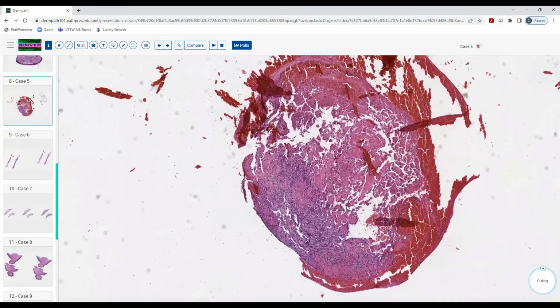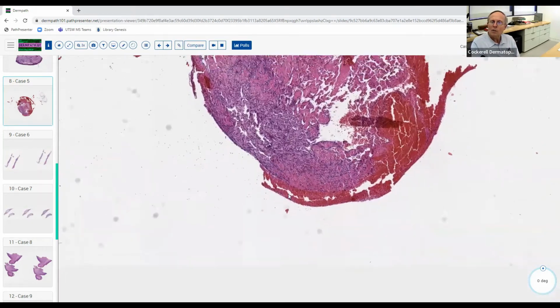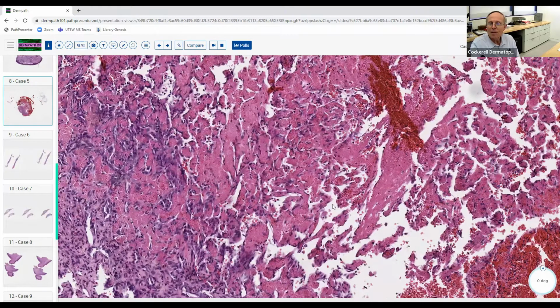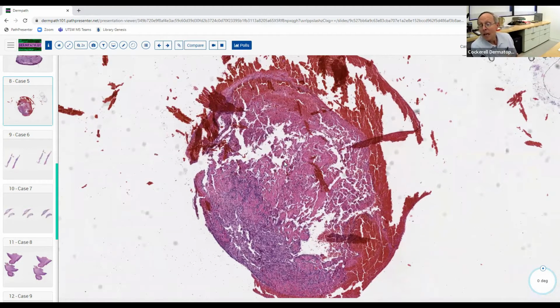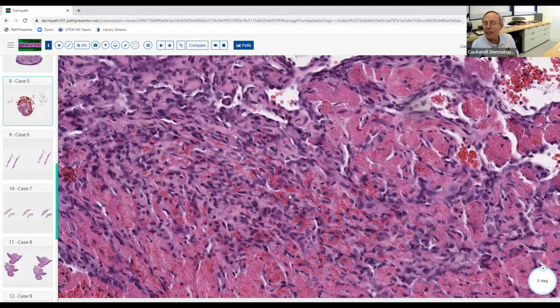Is that hemangioma? Well, it's not just a classic hemangioma, but notice the architecture, the fact that it's got this very round appearance. It looks like it maybe just popped out of there. It's got all this fibrin and inflammation and red cells here. Is that thrombosed? Yes, it's a thrombosed blood vessel that's undergoing organization and recanalization, and then here it's actually formed a granulation tissue reaction. So this has a specific name. We don't just say it's a thrombosed blood vessel. It's actually got a name also. Anybody know what the name of this is?